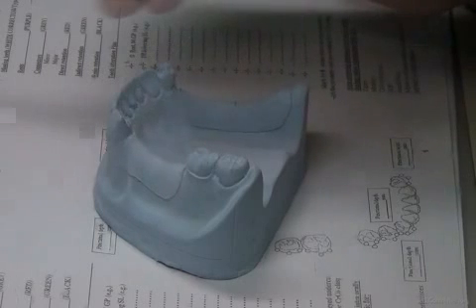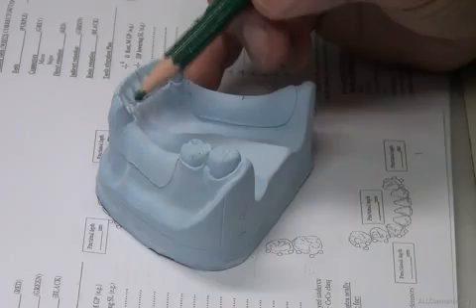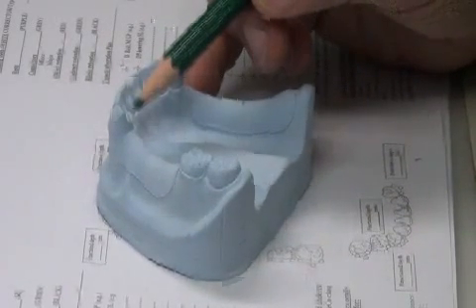But once you choose a cingulum rest, and you don't want to put a plate on the tooth, make sure you really prepare your wall. Do you remember when we said preparation of the rest? We don't only prepare the rest on the tooth, on the rest area, we should make this flat, right? In the upper, the flatness of the upper part of the tooth could be done parallel to the guide plane. Okay? So try to make it parallel.